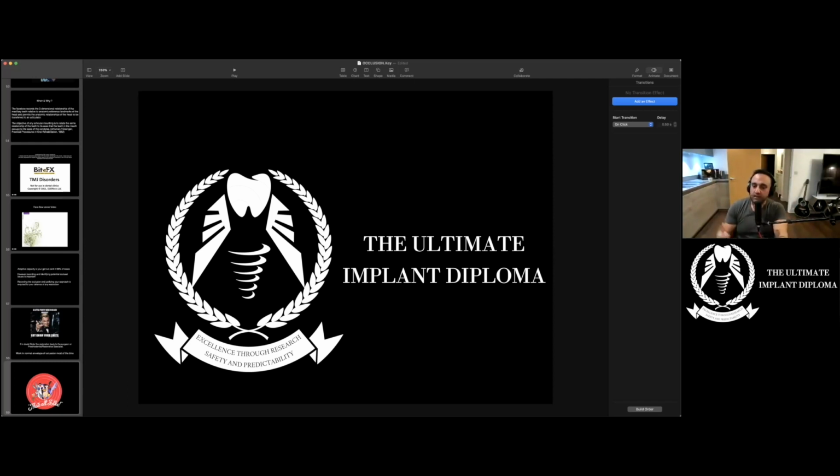The papers and the general rules are that this is where the limits lie, but it's still averaged out. If you have very, very D1 bone, for example, there's going to be very little blood supply, and if you put implants close together, you're going to get necrosis. It doesn't mean that you can't bend the rules. And is it totally wrong? No. But it shows that you're thinking about these sort of things.